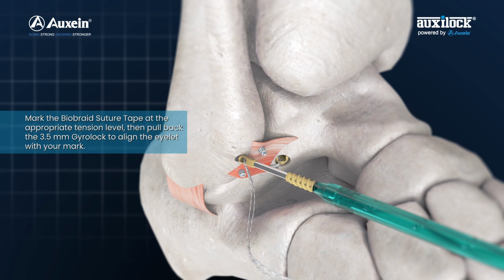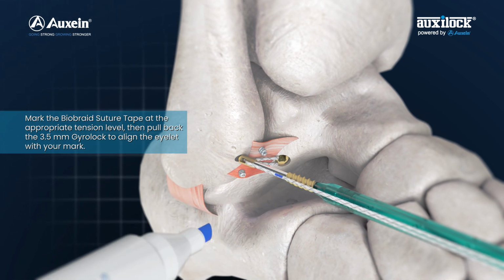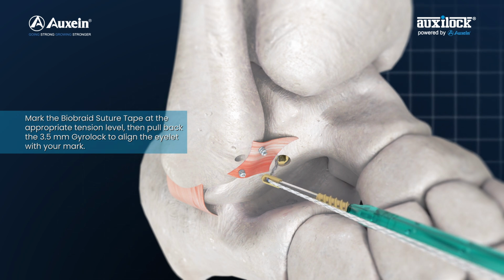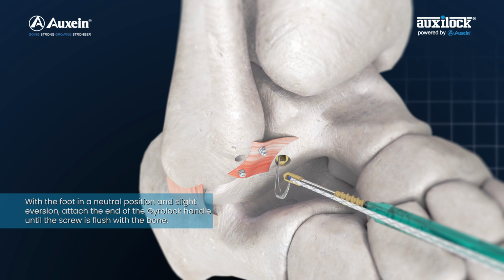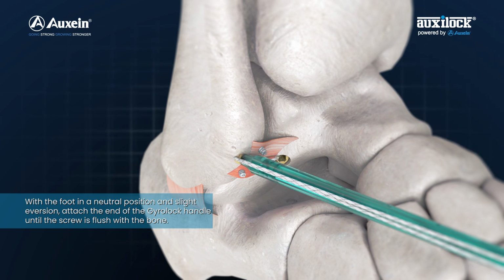Mark the BioBraid suture tape at the appropriate tension level, then pull back the 3.5 mm gyrolock to align the eyelet with your mark. With the foot in a neutral position and slight eversion, attach the end of the gyrolock handle until the screw is flush with the bone.